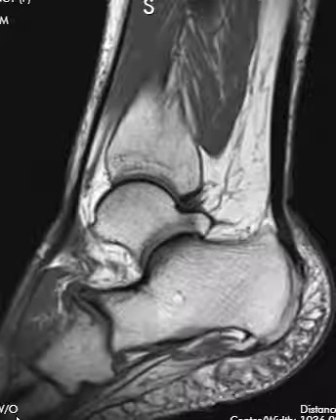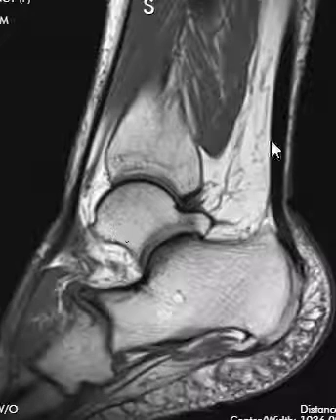Hello, this is Dr. Gay from First Look MRI, and this is a video on how to read an MRI of the ankle. Now, an MRI of the ankle is pretty complicated — there's so much anatomy — but we have a step-by-step process we run through, and here is what we do.